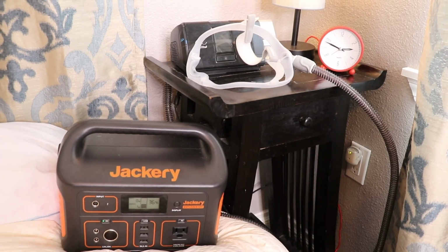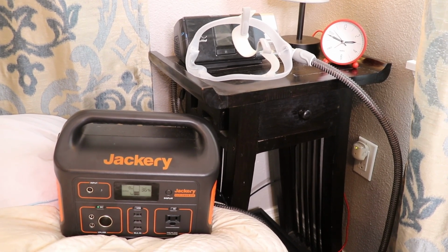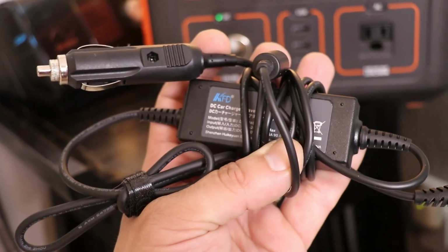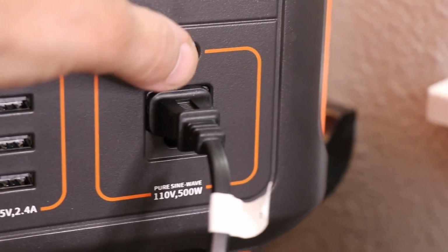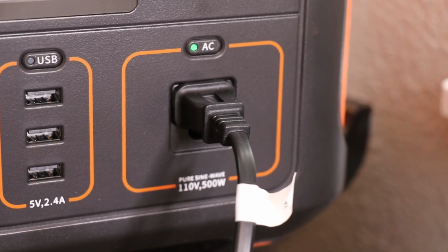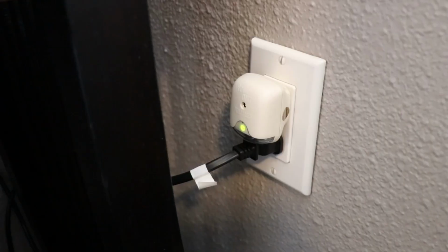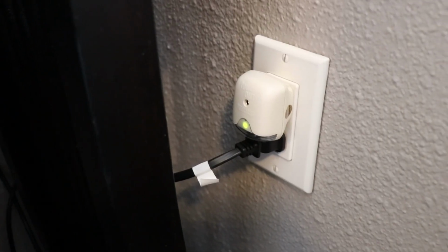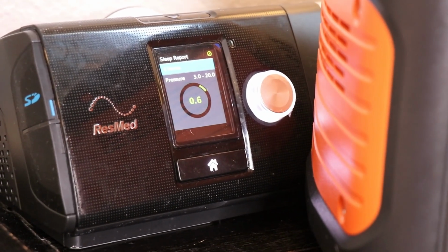So here are 2 things that you're going to want to make sure to do to get the most efficiency out of your Jackery power bank. Number 1, use a DC adapter. You will lose about 10% in the conversion from AC to DC. So that's why you don't really want to plug it into the AC outlet on the Jackery power bank, like you would normally when plugging it into your wall outlet. It's much more efficient to use a DC adapter that gives you a lot more runtime on your CPAP.